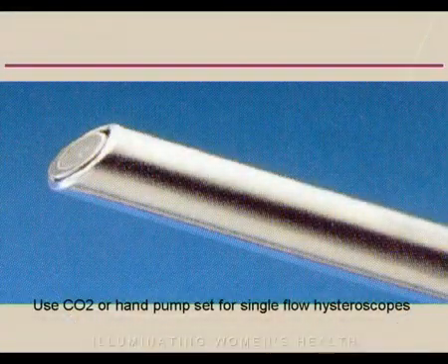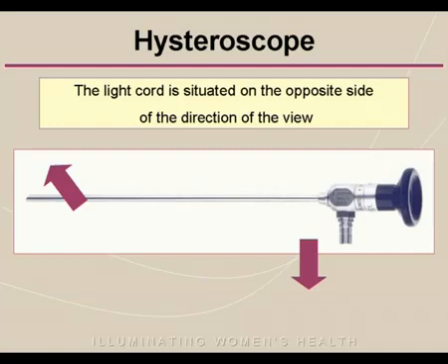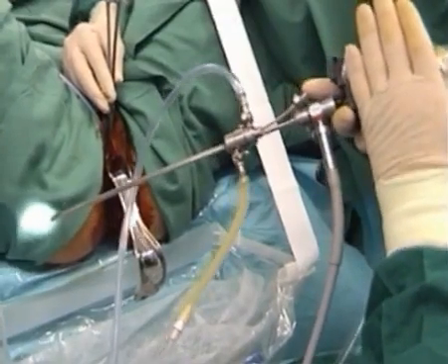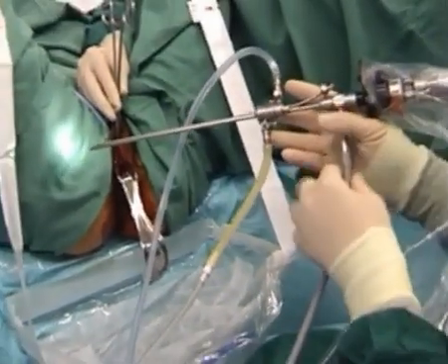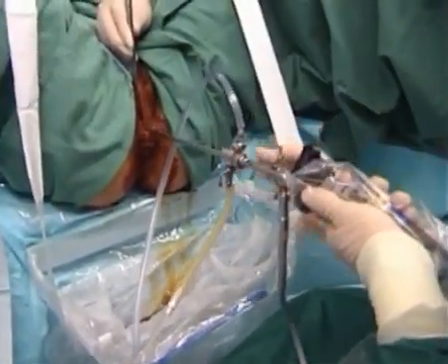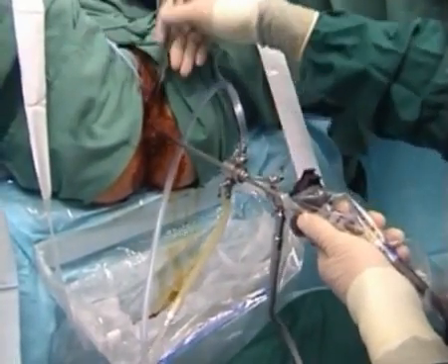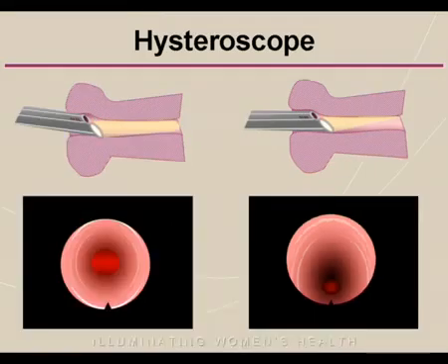The bevel of the hysteroscope is the presenting part of the scope. This corresponds to the notch on the monitor screen and is always located on the same side as the light lead. For introduction of the scope into the cervical canal, the light lead should be pointing downwards in the so-called neutral position. Importantly, to avoid loss of orientation, the camera itself should remain in the vertical position at all times and not be rotated. In the neutral position, the view from the hysteroscope is 30 degrees obliquely forward and upwards.